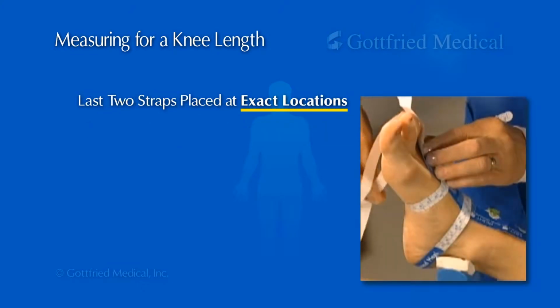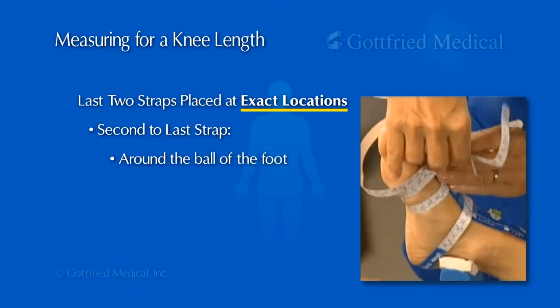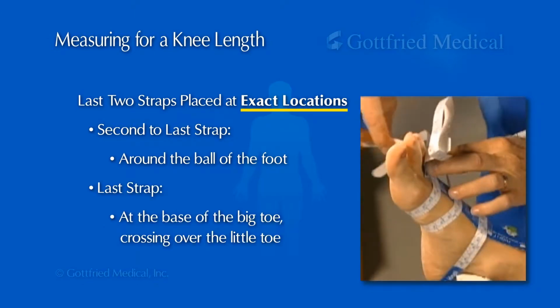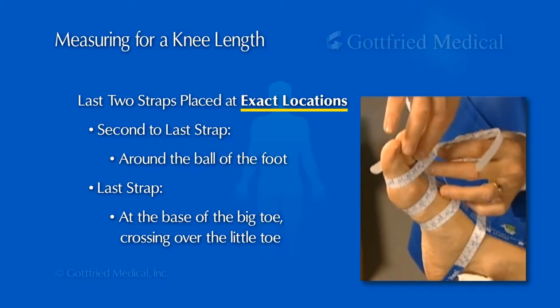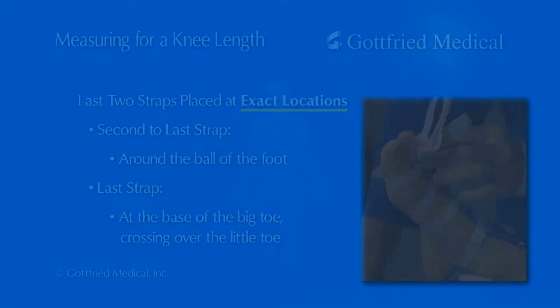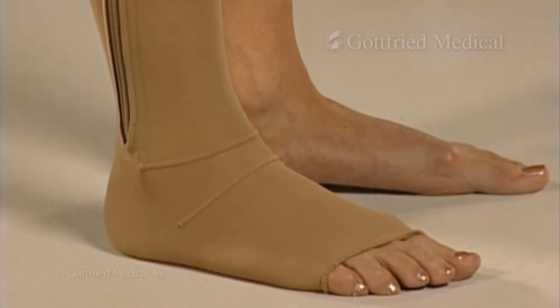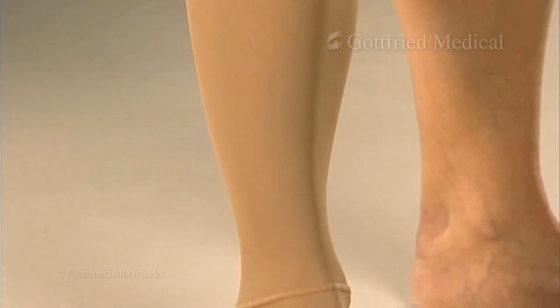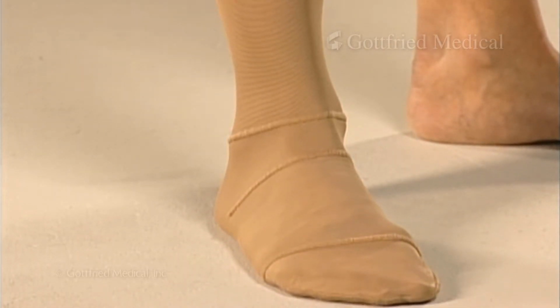The last 2 straps for the foot are placed at exact locations. The second to last strap goes around the ball of the foot, and the last strap goes at the base of the big toe, crossing over the little toe. These measurements ensure that the support stops at the base of the toes. If it's too short, it may ride up the foot. If the shape of the foot prevents correct placement of these 2 straps, then a closed toe support is recommended.